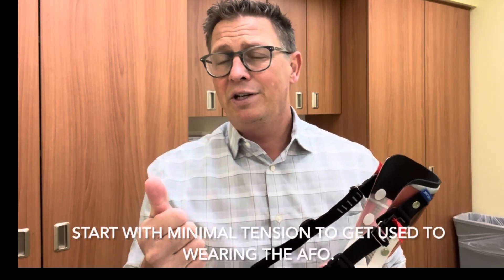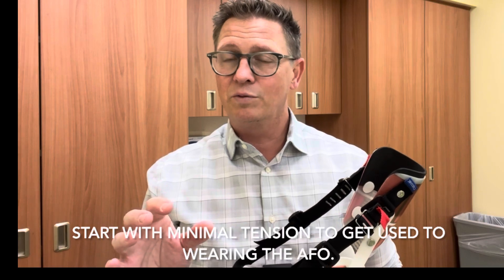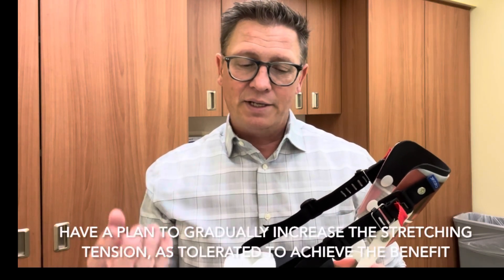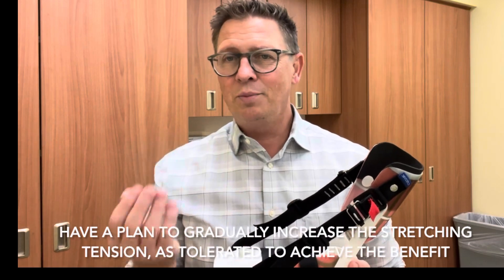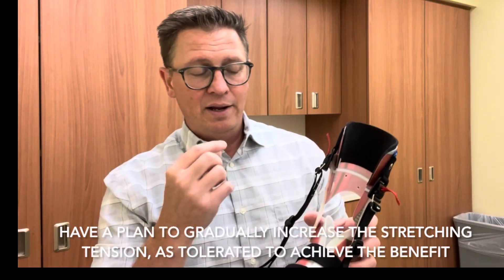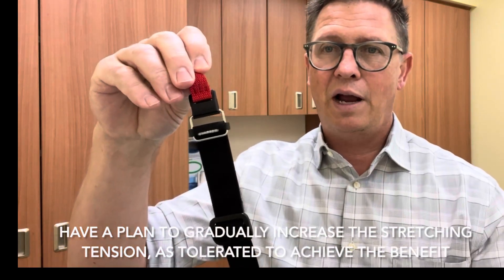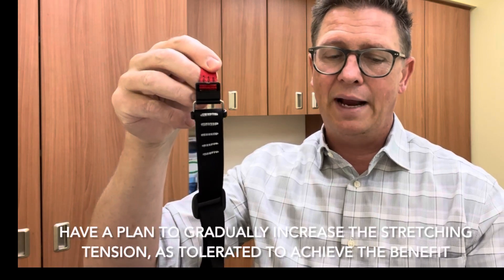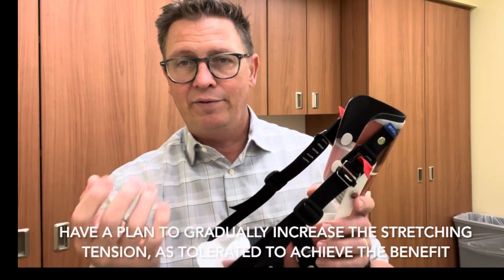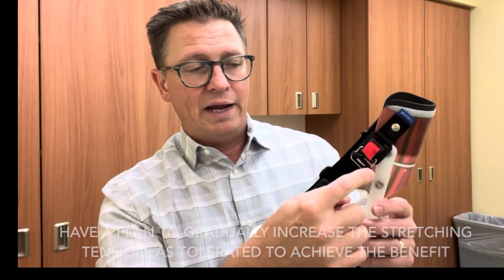Depending on how tight you do those straps. The biggest challenge with any nighttime AFO is, number one, making sure that it's going to be tolerable — so we're not pushing so hard that it's causing too much discomfort, issues with sleep, or pain for the patient. And number two, making sure that you are pushing hard enough so that you're actually doing some good. What I suggest is putting marks on these straps — I've used a silver paint pen to put hash marks on them. I recommend having this done, either by yourself or by your orthotist.